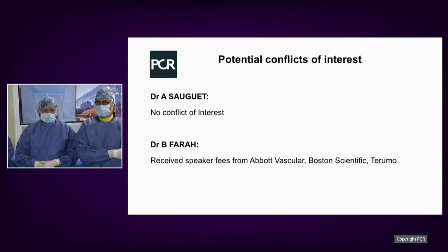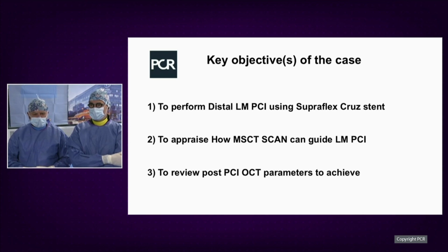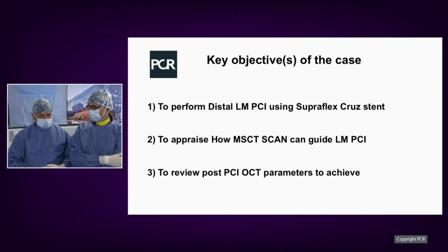So the key objective of the case, first, is to perform the distal left main PCI using the Supraflex Cruz stent, to appraise how the new technology of MSCT can guide left main PCI, but I think that you demonstrated that already perfectly. And after, to review what are the post-PCI OCT parameters to achieve for the safety of the patient.